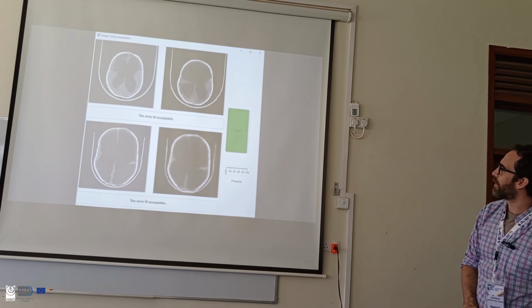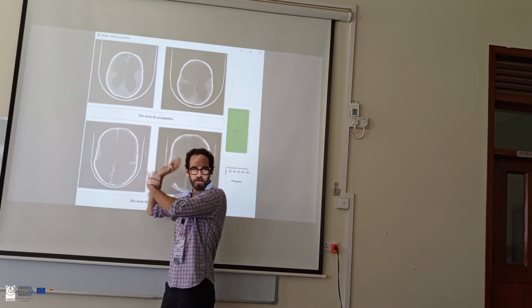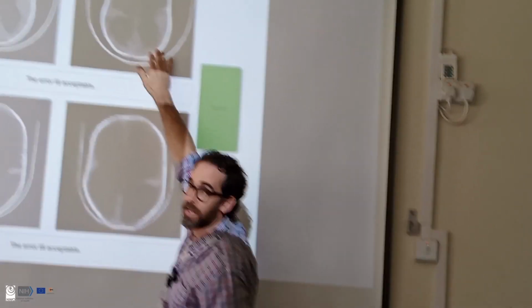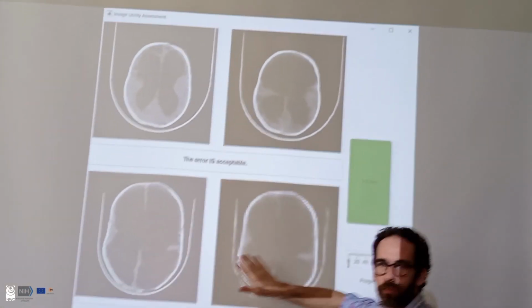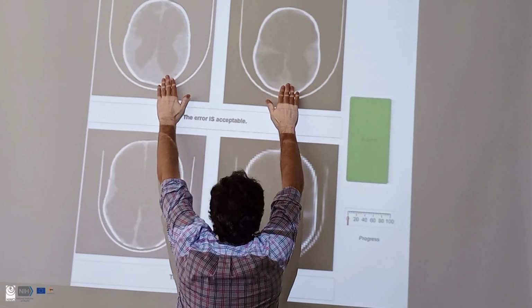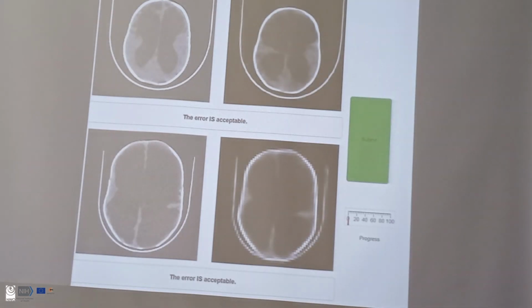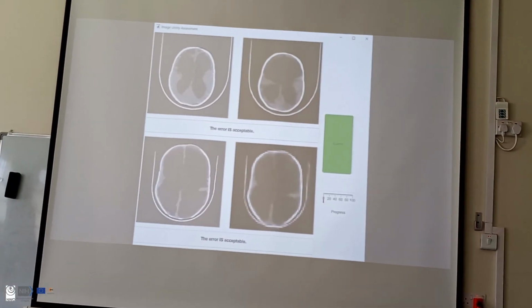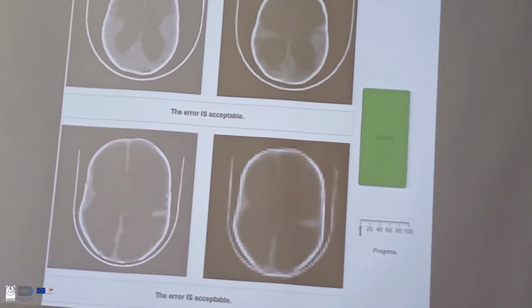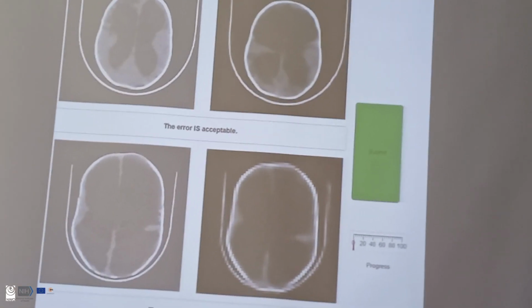And so here's a panel that they would see. So this was ground truth. There were some instructions that you guys didn't see ahead of time. I apologize. But basically, this is ground truth, and this is the enhanced image. Ground truth, the enhanced paired image. So you see the pattern there. So they were having to look at these two together and then these two together and try to see if the errors matter to them. What do you guys think? The top panel. What do you think about that comparison? And I know you guys can't quite see all the detail. I apologize for that. Do you guys think that the errors matter there?